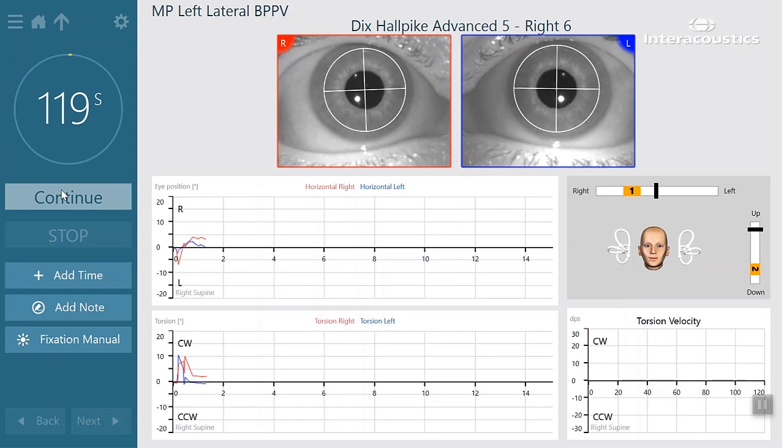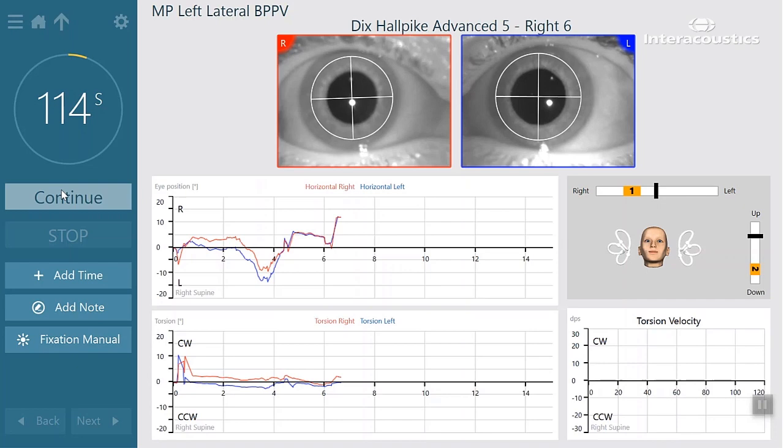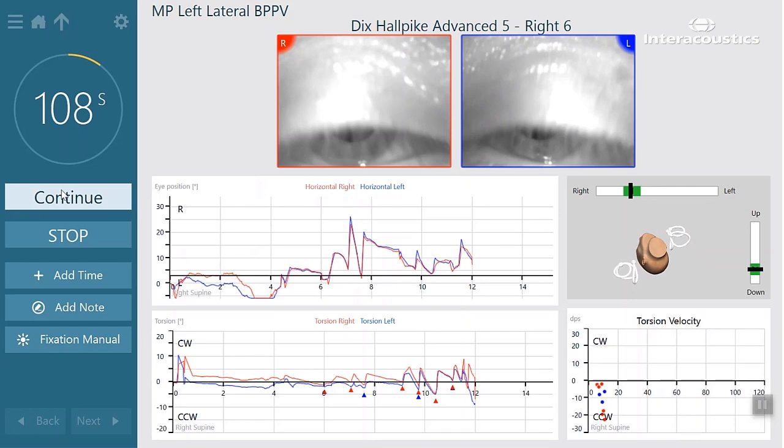This precision provided by the 3D model takes the guesswork out of the evaluation, gives the examiner confidence, and ultimately leads to better posterior canal BPPV diagnoses.